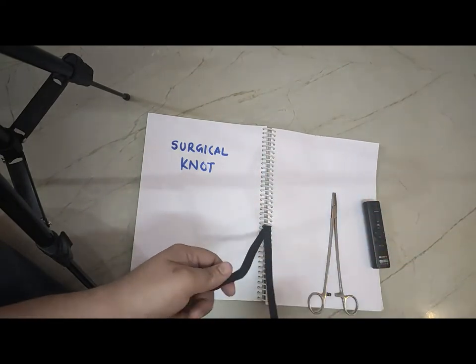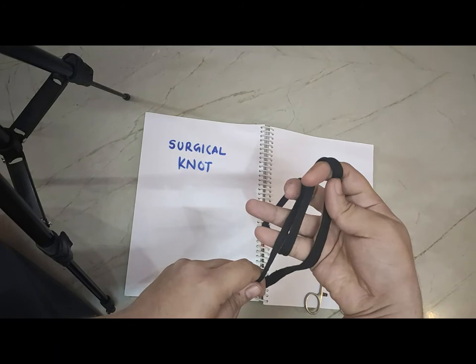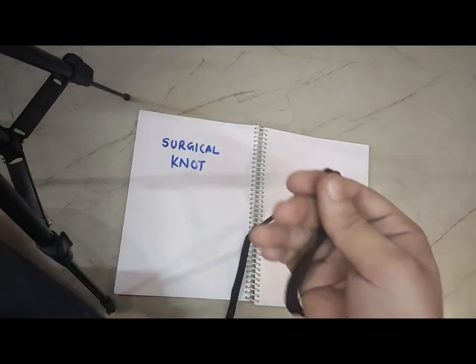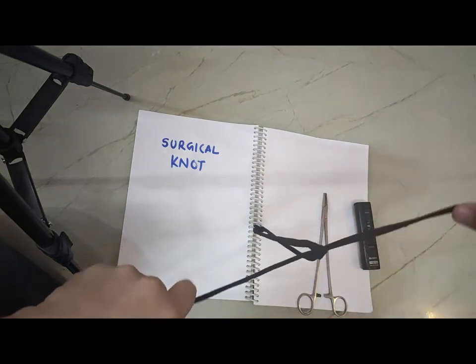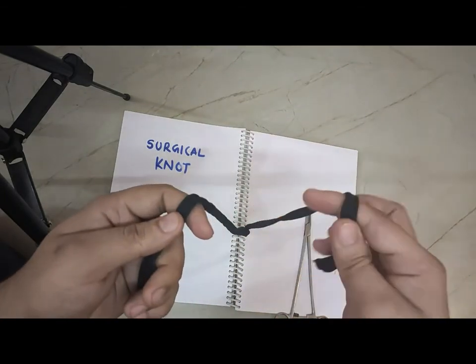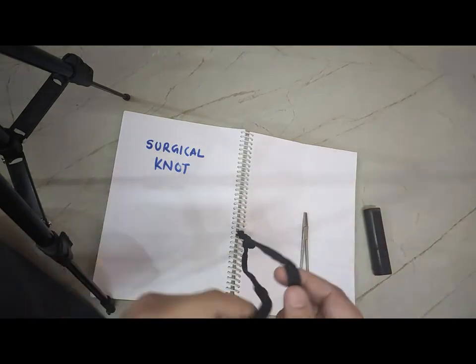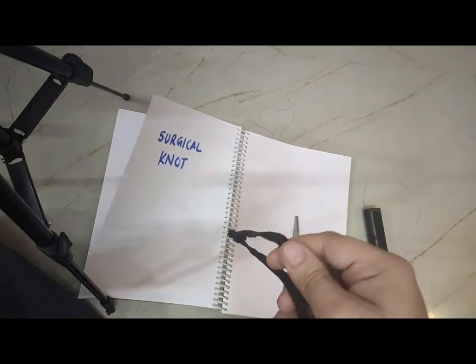Now after the 3 steps, the work of this finger will come. See — 1, 2, and 3. Now this finger will take the second end behind the first end and bring that end into the knot. This is the first knot. Congratulations! Again: 1, 2, 3 — middle finger goes inside. Done. This is how we make the suture knot. Thank you.